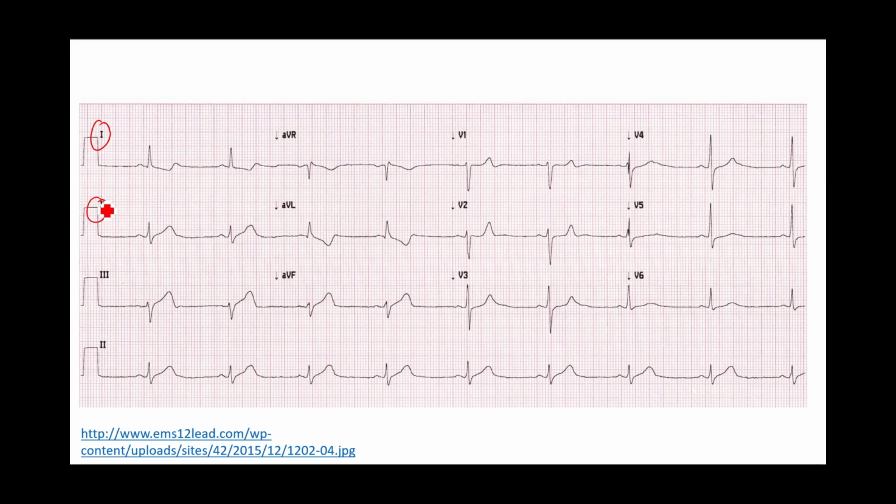Okay, we are looking at lead 1, lead 2, and AVF again. Lead 1, you could tell, is positive because the QRS is more positive than it is negative. Lead 2, depending on how close you look at it, is either a tiny bit positive or isoelectric, meaning it's going up and down at about equal amplitude. AVF, if you look closely at it, is negative.